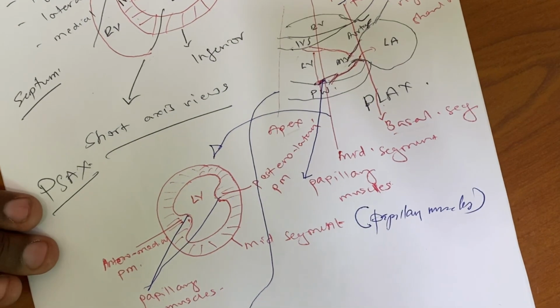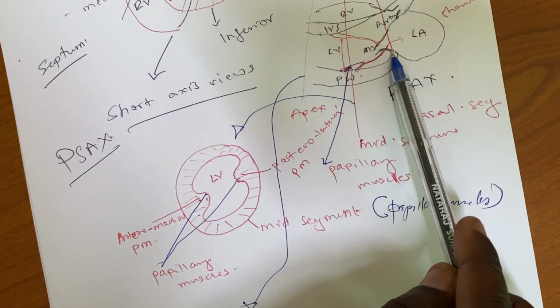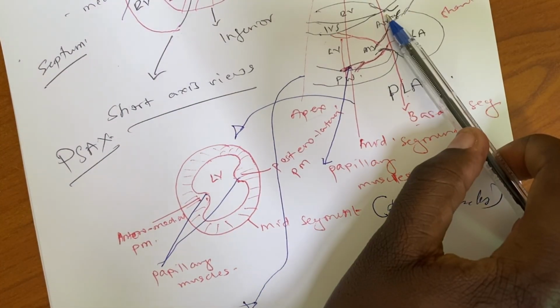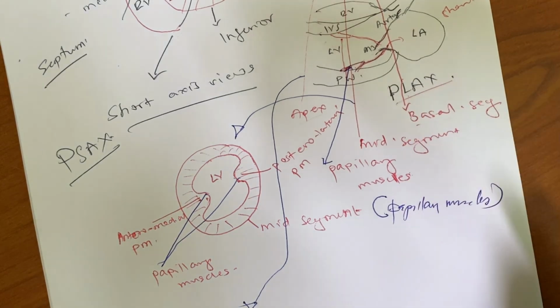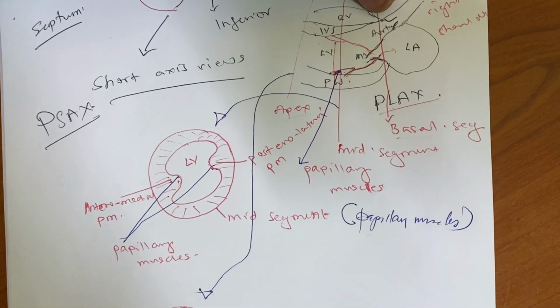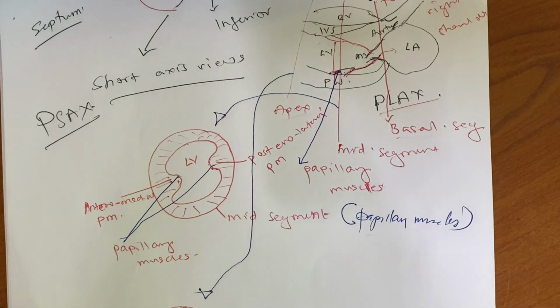When I do the first investigation, this is how you begin the procedure. You begin at the aortic level, the parasternal long axis. When you see it clearly, I make a cut like this, then save it without putting color, without measuring.